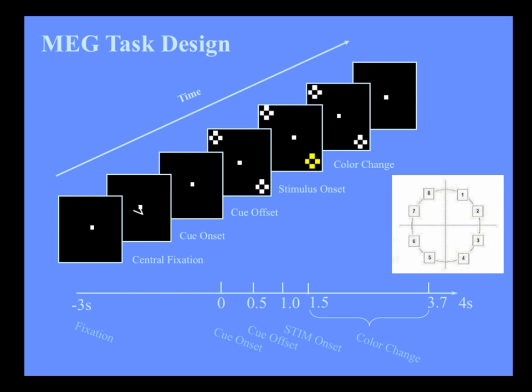And just to give you a further example of that, this is a visual stimulation experiment where we're going to flash this little checkerboard in each of the 8 octants of the visual field. We've asked the subject to stare at the dot in the center of the screen, and then we're going to take this little checkerboard and flicker it at each of these 8 locations.